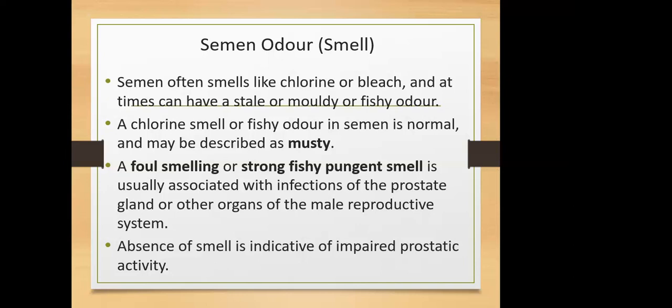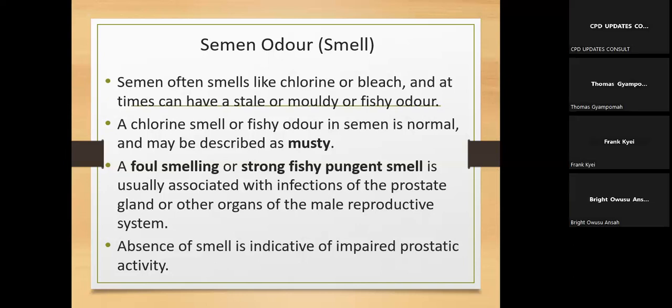It has an extraordinary, strong, fishy, pungent smell, a foul smell of a sort. Then you have to write it like fishy, pungent smell, and that connotes an infection. It gives the impression that there's an infection within the genitourinary tract. All right.